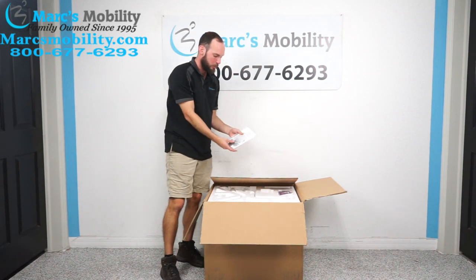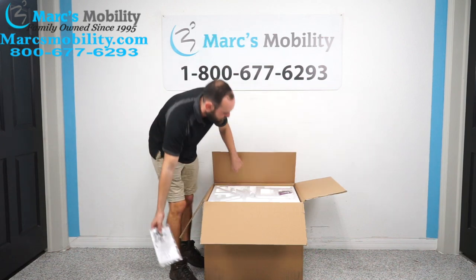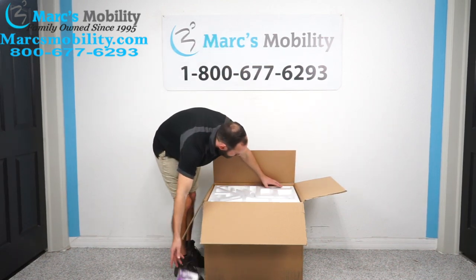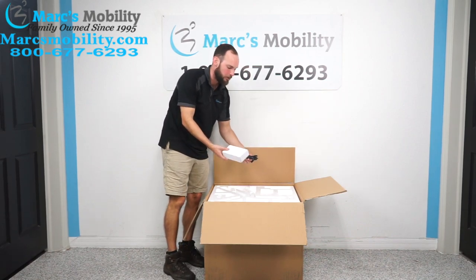You've got your owner's manual with your mounting brackets and your Allen screws. We've got some more product inserts, and it looks like our battery and our battery charger.